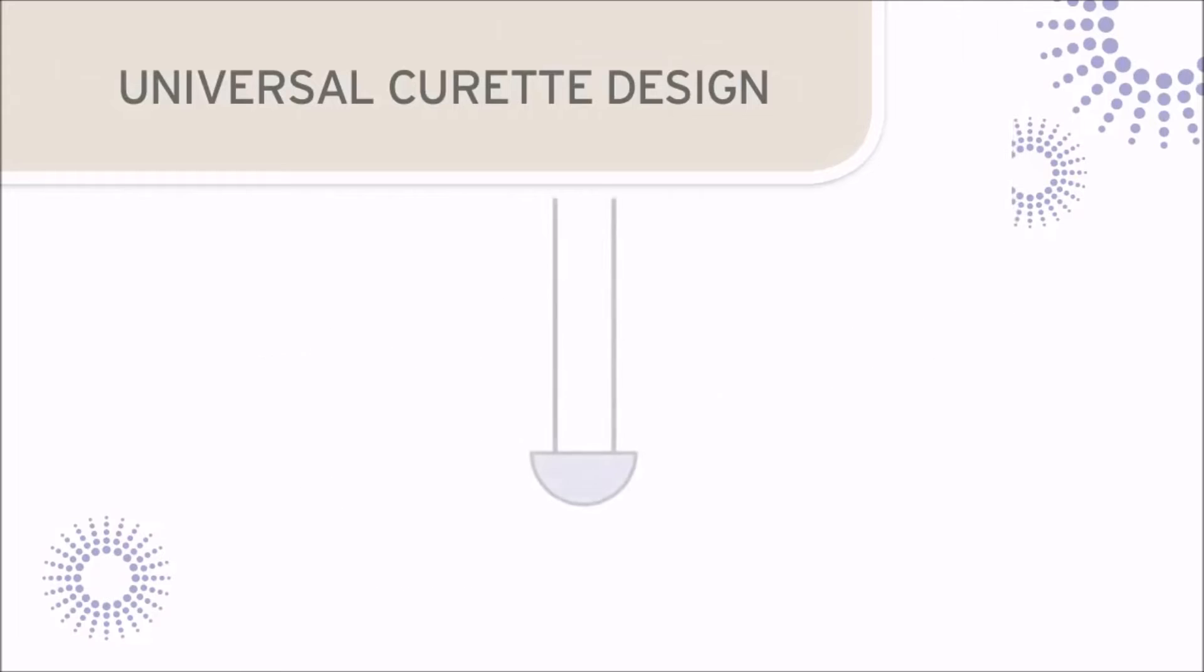The under surface of this blade is rounded and the cross section view reveals a semi-circle blade shape. The facial surface of the blade of a Universal Curette is positioned at a 90 degree angle to the terminal shank. This is a key factor to remember when positioning the blade and stone during sharpening.